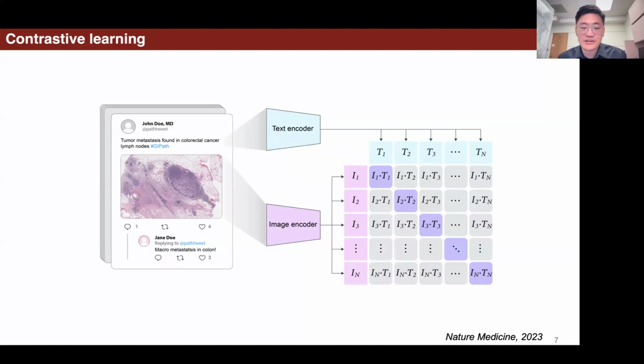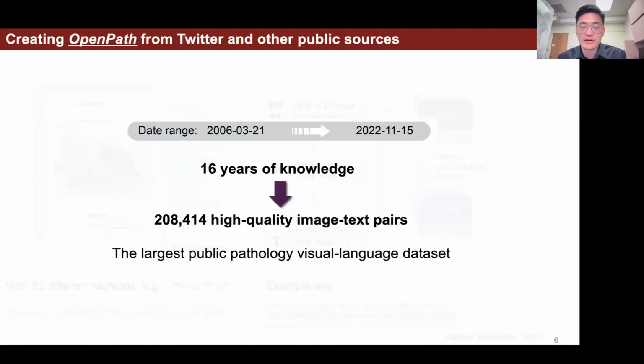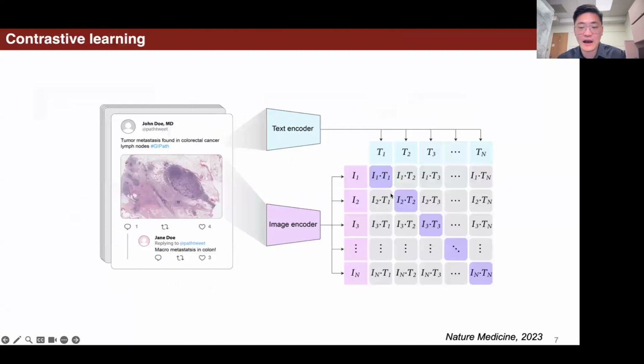Just to mention, those medical image-text pairs do not only come with H&E images and IHC images, they may also come with some immunofluorescence images or CODEX images. Although I don't think that would be that much, it's definitely including those image-text pairs, and that can be really helpful in our downstream analysis.